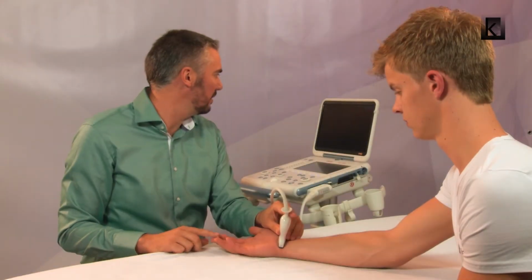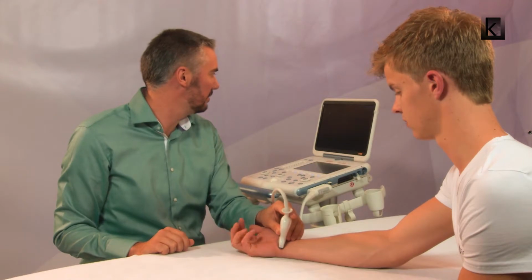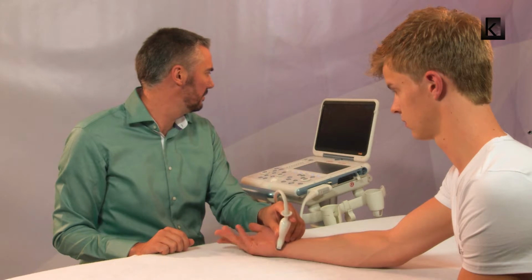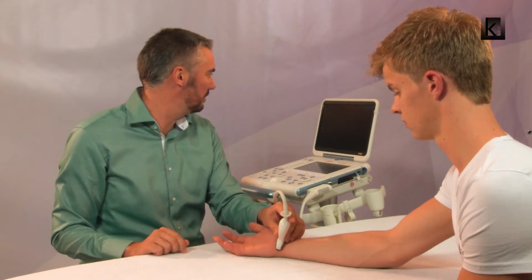We ask the patient to flex and extend his fingers. Due to activating the flexor muscles, the median nerve will move inside the carpal tunnel from left to right, which is correct anatomical behavior.